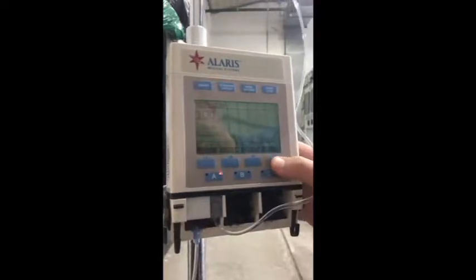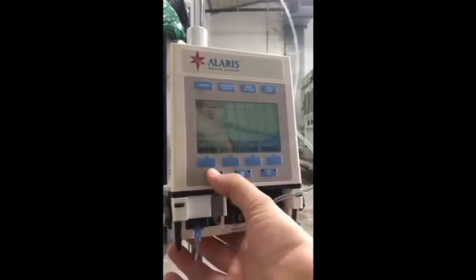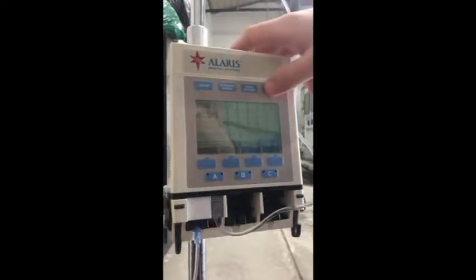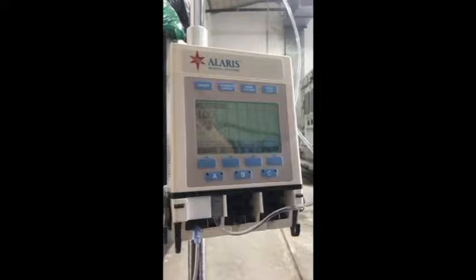First we hit the quiet button. I come over. Clear occlusion between channel and container. Check vents. And so if it was a glass bottle, we would have to make sure that we have the vent open. That way air can go into the glass bottle as fluid comes out of the bottle. So we check, make sure everything is clear. And then we press start. And now we are infusing.